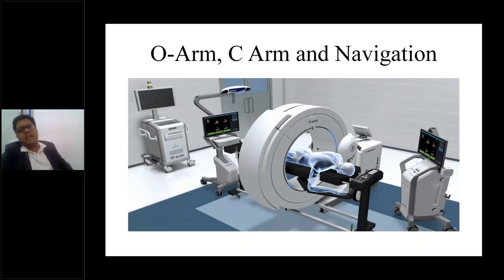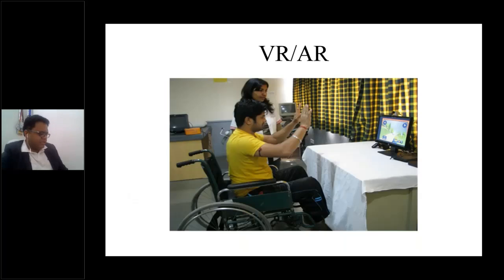VR and AR are being increasingly used these days to rehabilitate spinal cord injured, osteoarthritis or orthopedic patients. It's a simple game in which we provide the patient with a game, let's say Pac-Man. I have a patient with a wrist fracture and metacarpal fracture, and I tell that patient, okay, the first option is you go to a physiotherapist and she does all kinds of exercises. Maybe the patient got bored with that physiotherapist.